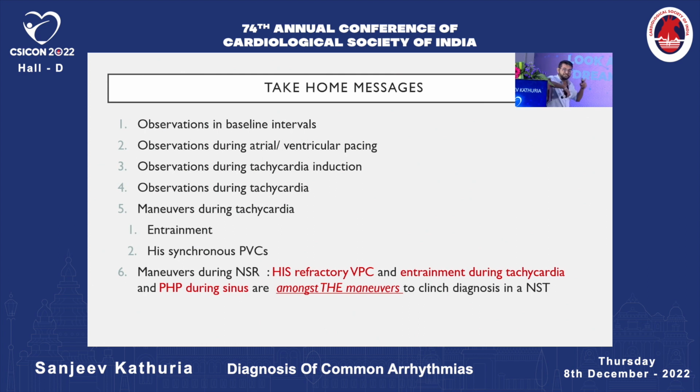Observations during tachycardia induction itself. That means when the tachycardia is being induced, your maneuvers like the premature ventricular contraction or an entrainment maneuver. Observations during this tachycardia. The entrainment and the His synchronous VPC are the most important two things which you do in your lab to make sure that you are able to reach a diagnosis.